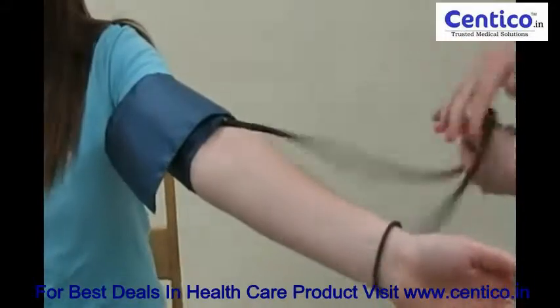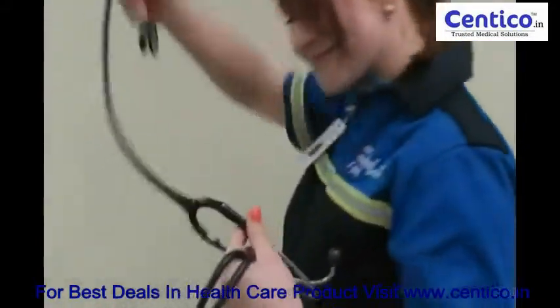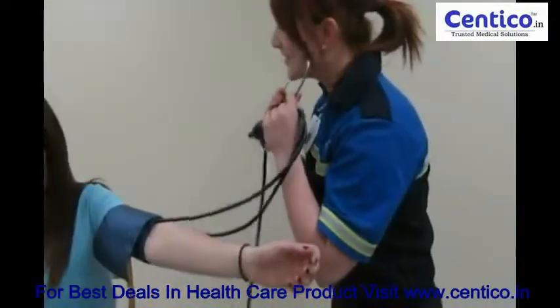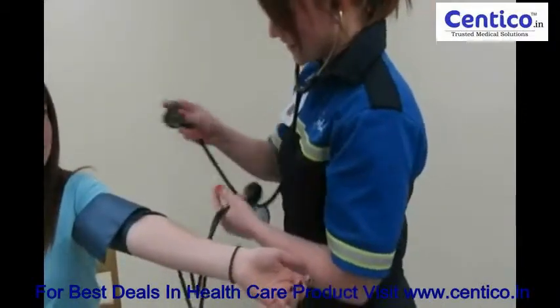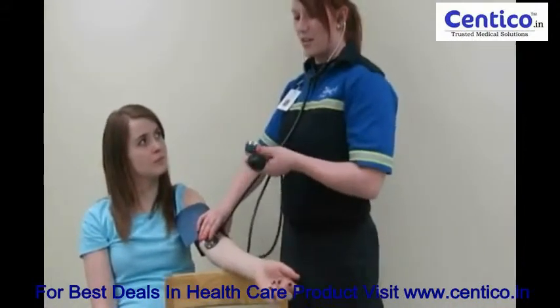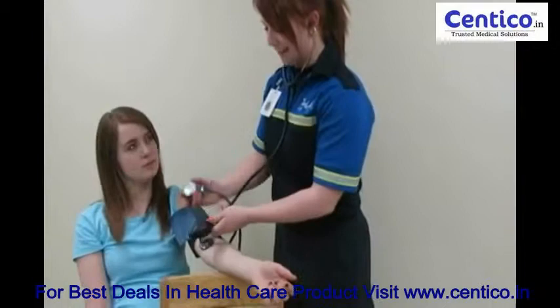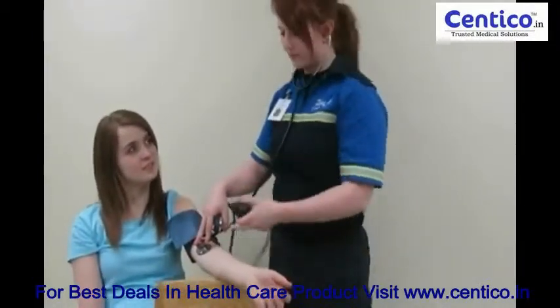Then, to hear the heartbeat, they use a stethoscope, which is an acoustic device for auscultation. They place the round metallic side of this device on the located artery. Now that the sphygmomanometer and the stethoscope are installed, I have to be sure that the valve is closed to start to pump the cuff.